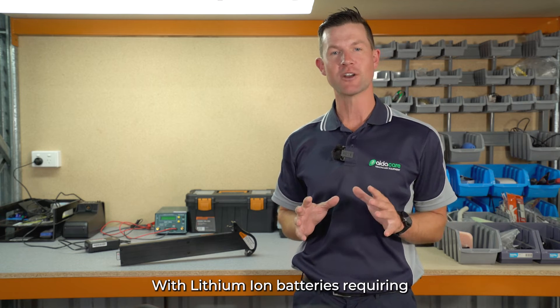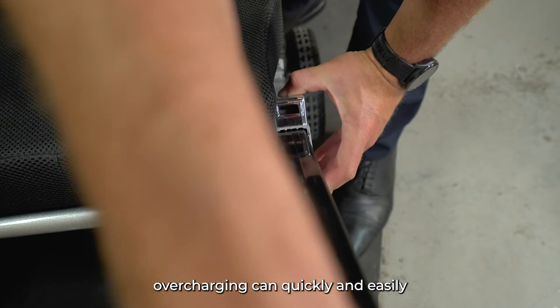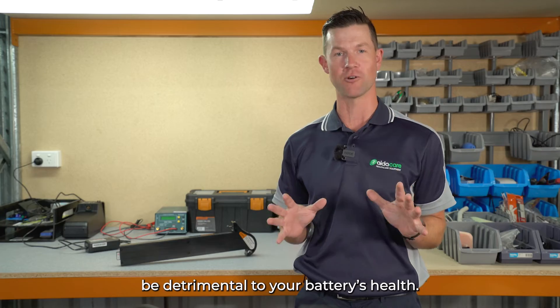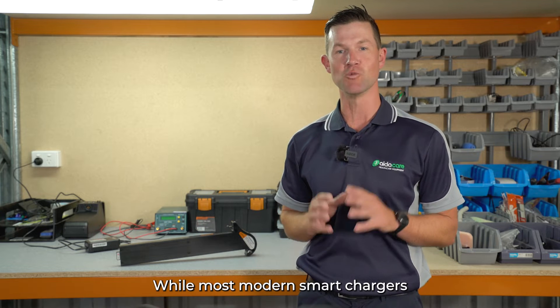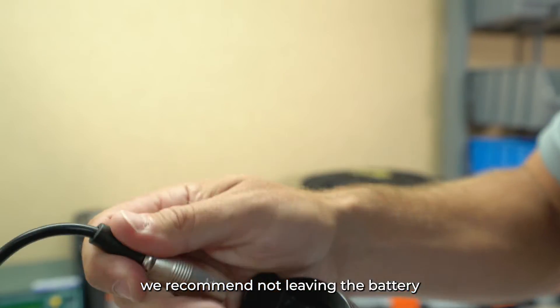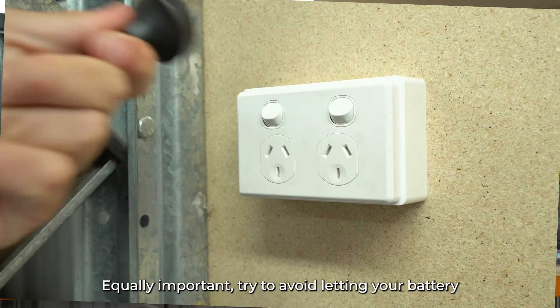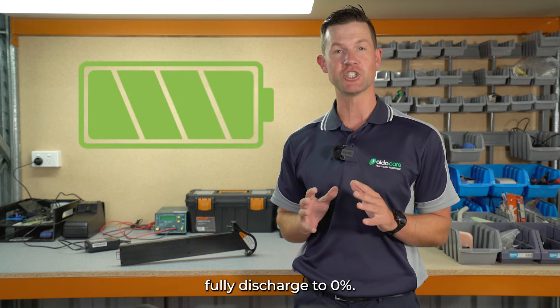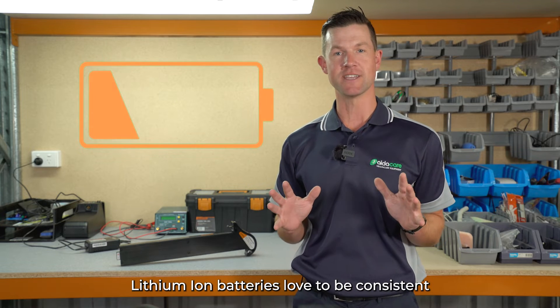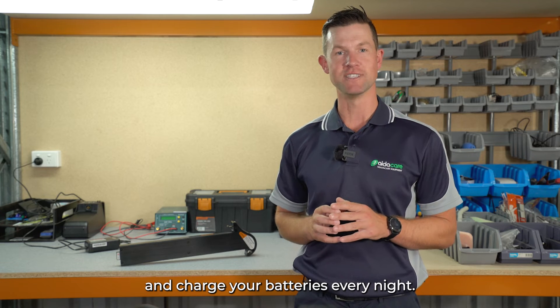With lithium-ion batteries requiring regular charging to maintain longevity, overcharging can quickly and easily be detrimental to your battery's health. While most modern smart chargers will turn off once the battery is fully charged, we recommend not leaving the battery on the charger once fully charged. Equally important, try to avoid letting your battery fully discharge to zero percent. Lithium-ion batteries love to be consistent, so keep a nice regular charging schedule and charge your batteries every night.